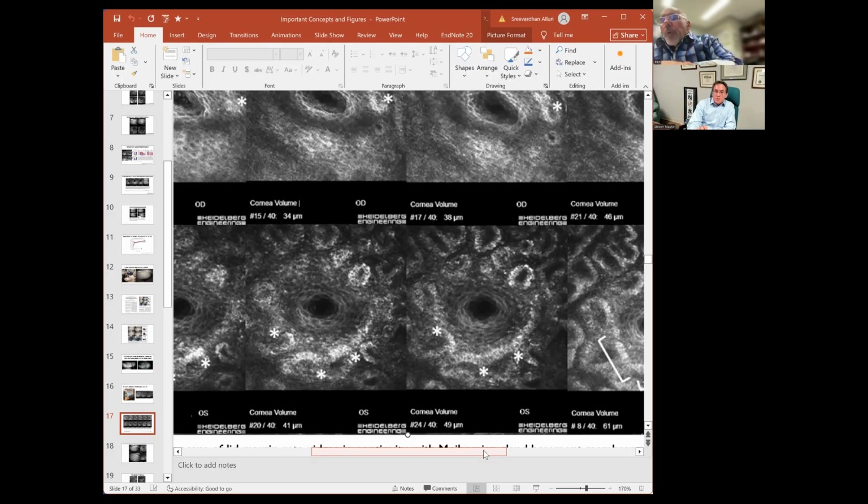So this is post probing, underneath. This is normal. These are normal structures. What we're showing here is how these ridges are essential for the health of the meibomian gland. As we're going deeper in the meibomian gland, we made this discovery, reported last year.